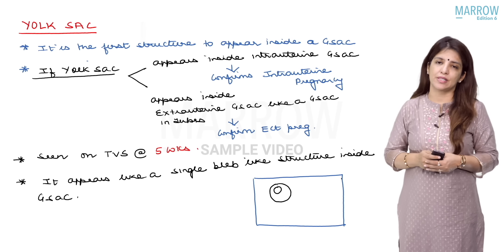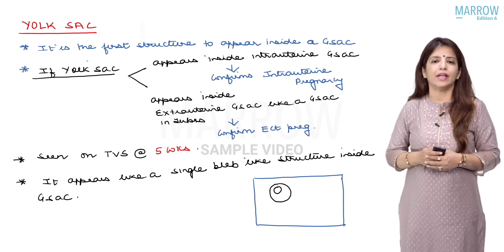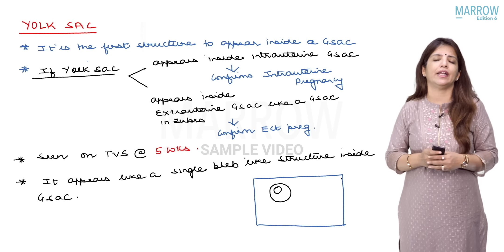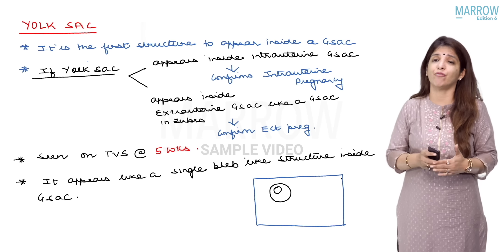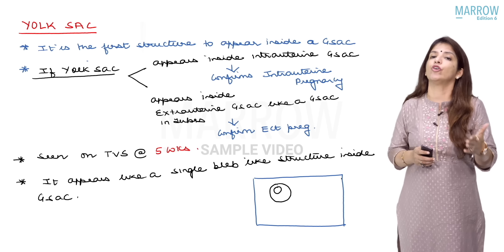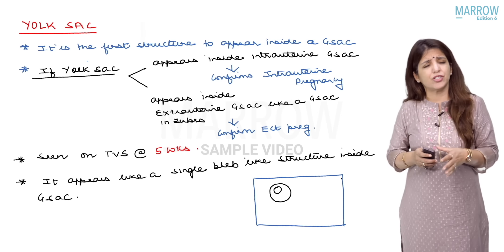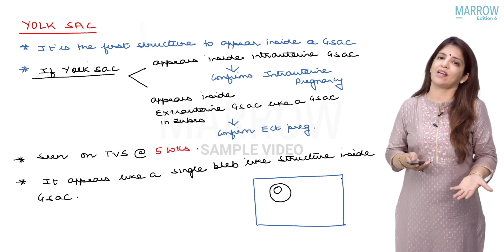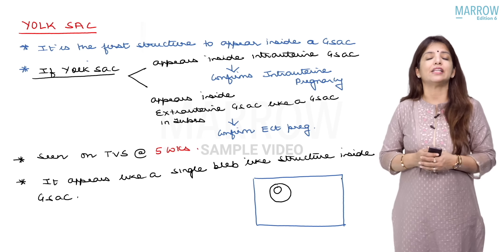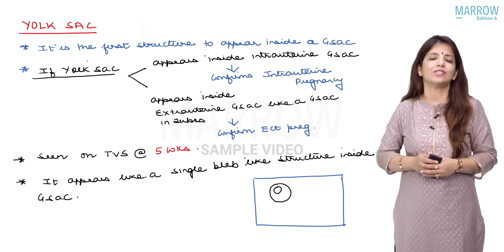The next structure which appears is a yolk sac. The yolk sac is the first structure to appear inside a gestational sac. If a yolk sac appears inside an intrauterine sac, it confirms intrauterine pregnancy; if a yolk sac appears inside a gestational sac in the tubes, it confirms ectopic pregnancy. A yolk sac can be seen on transvaginal sonography at five weeks and appears like a single bleb inside the gestational sac.